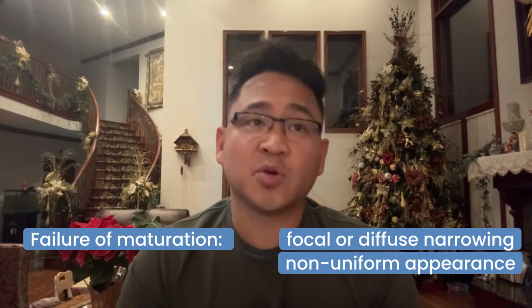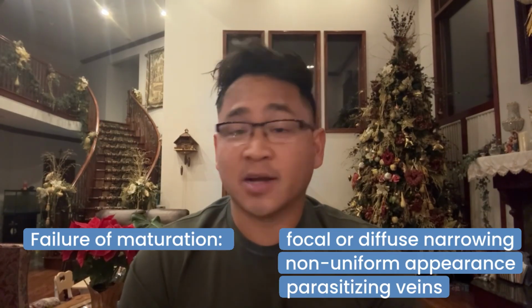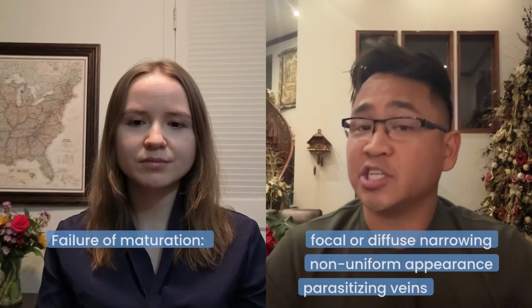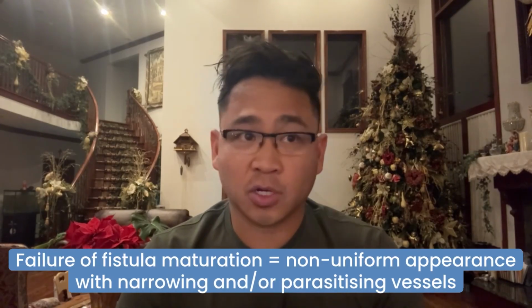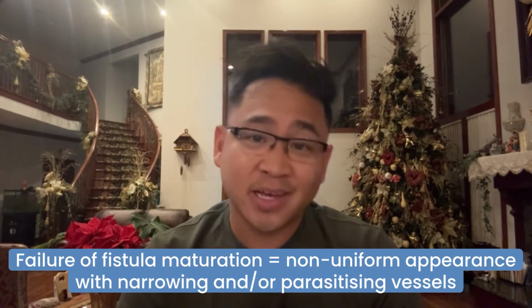And oftentimes you have vessels that are stealing blood away from it, parasitizing vessels, we call them, that are taking blood away from the cannulation portion of the fistula, which is where the dialysis is performed. If all the blood going into the fistula is taken away by these vessels, then the flow rates and the volume are lower. So, failure of maturation would look usually like diffuse narrowing or parasitizing vessels, usually both.